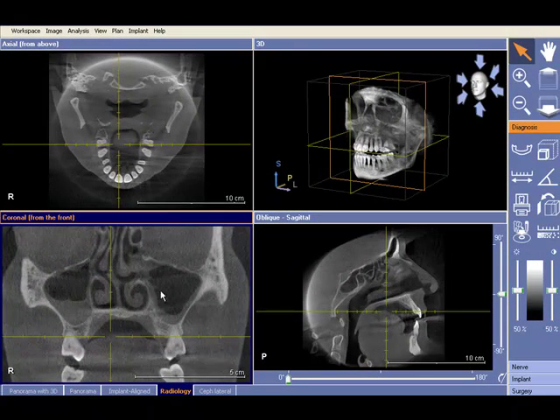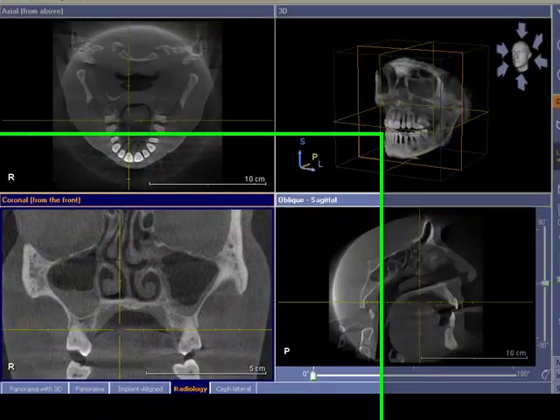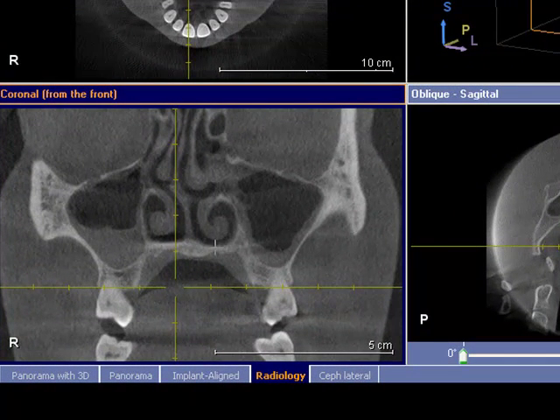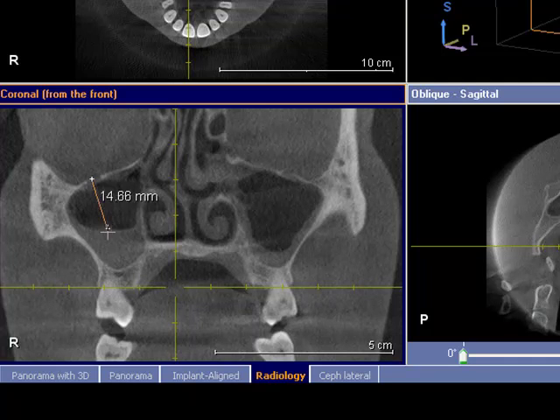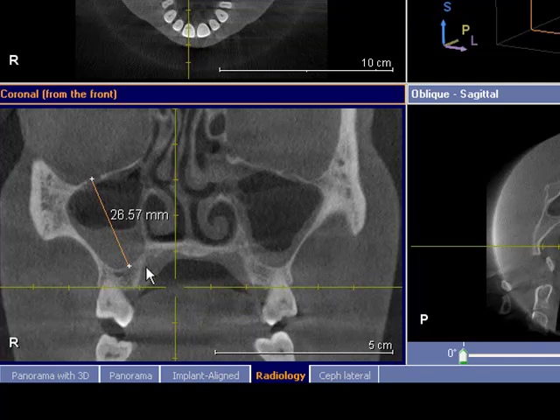So once again: measuring distance — left click once and left click again, and there's your measurement.